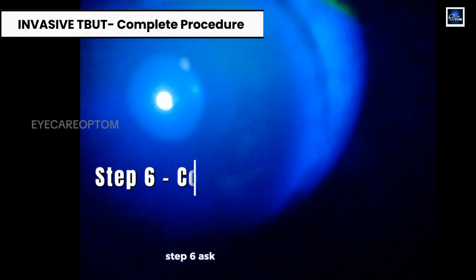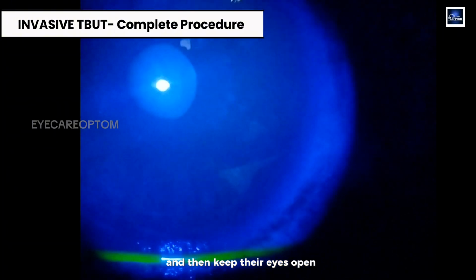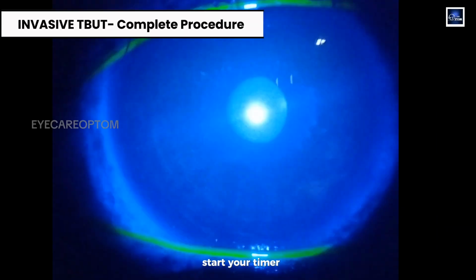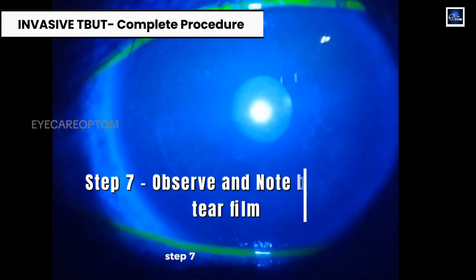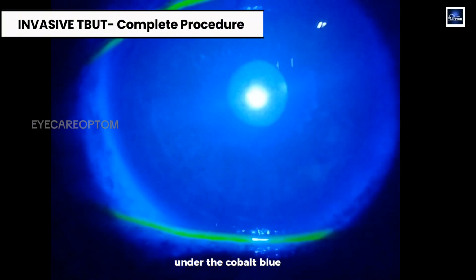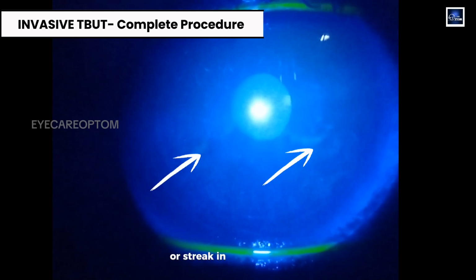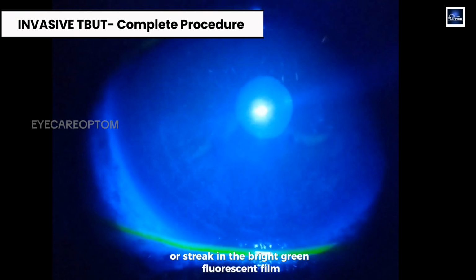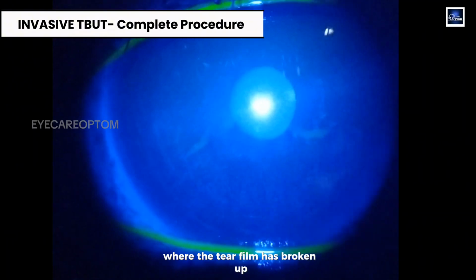Step 6. Ask the patient to blink once completely and then keep their eyes open. Start your timer immediately after the last complete blink. Step 7. Observe the fluorescent tear film carefully under the cobalt blue filter. Watch for the appearance of dark spots or streaks in the bright green fluorescent film. These are the dry spots where the tear film has broken up.